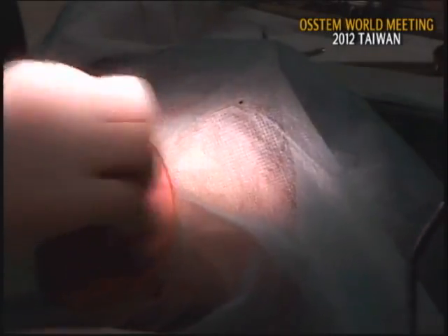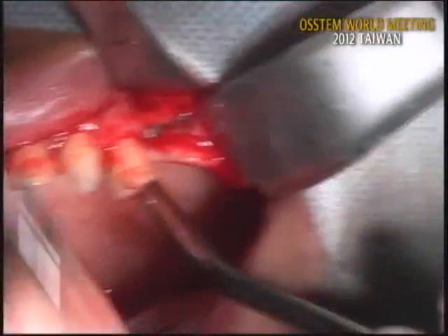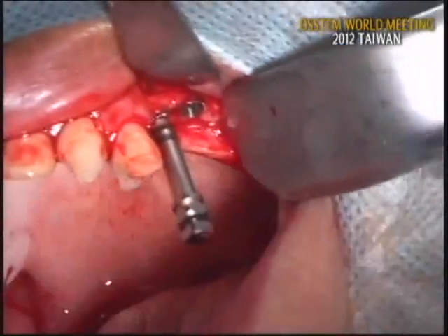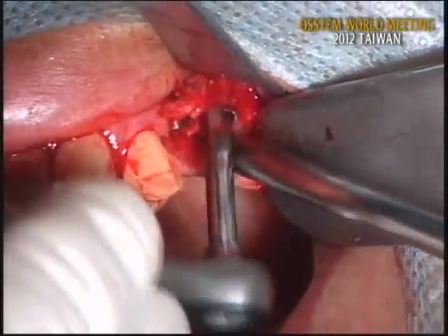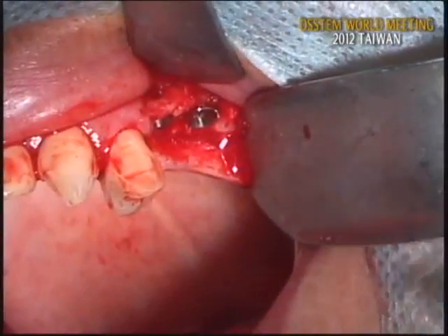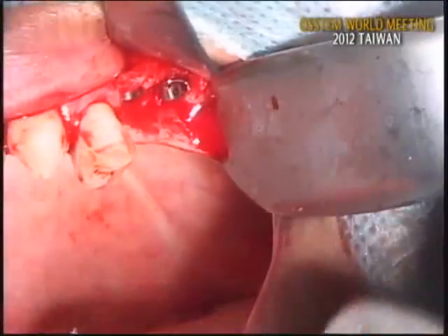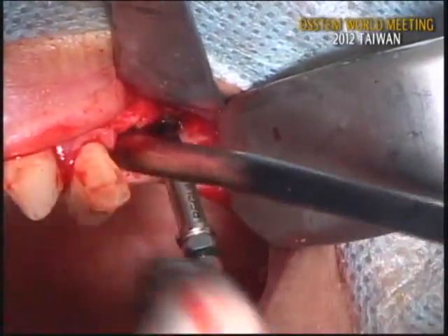And the final depth is better to control with the fixed driver here. This is the fixed driver. The torque seems around 30 Newton centimeter. Well, sometimes you can finish with one stage surgery. Let me check the insertion torque of this one. Not bad, actually.